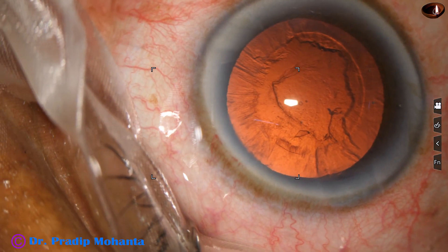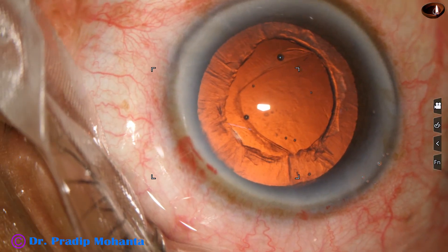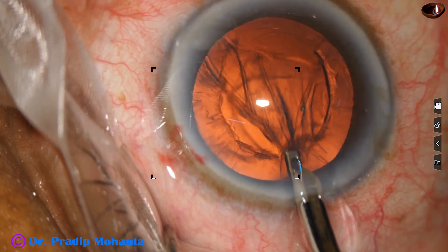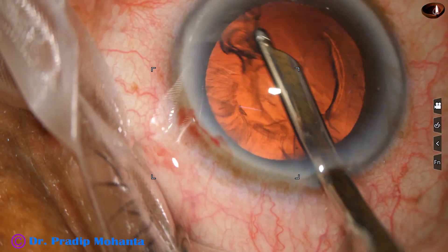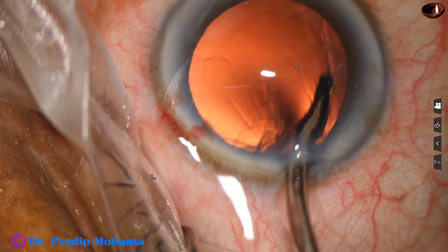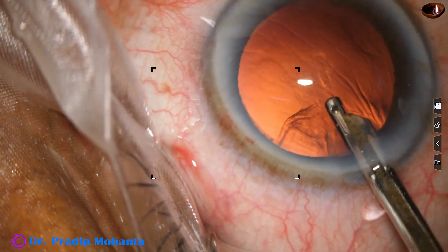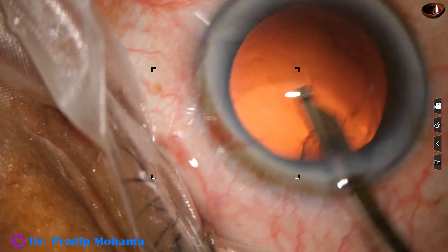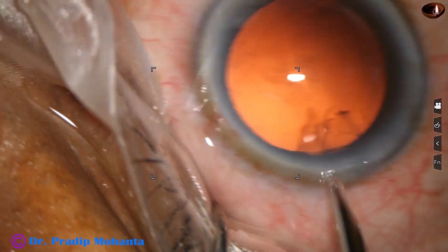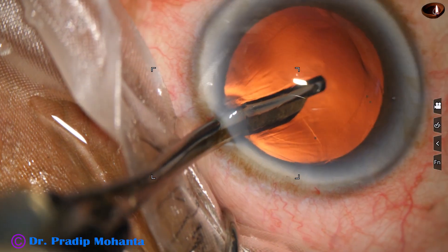Now is the time to remove the cortex. A bit of viscoelastic is added. I am using a 22 gauge Simcoe to remove the cortex. The viscoelastic just keeps the anterior chamber formed for some time, and we lift the anterior wall of the main wound to keep the chamber deep. There is a small nuclear piece — it is escorted out of the anterior chamber. Now the sub-incisional cortex is removed.